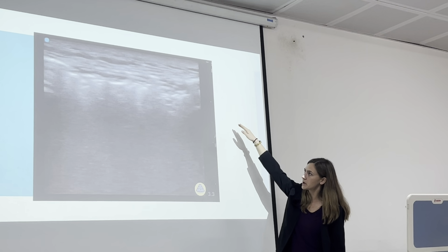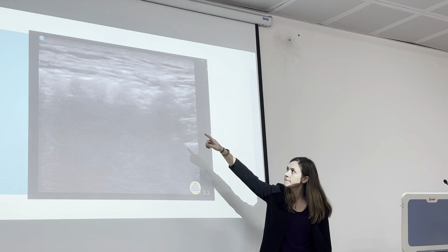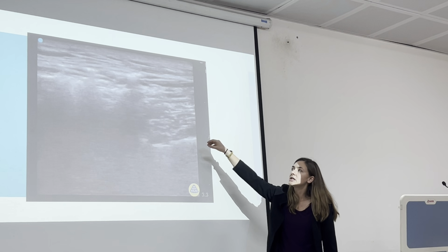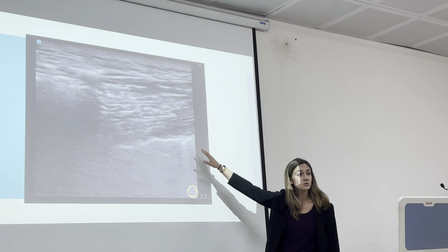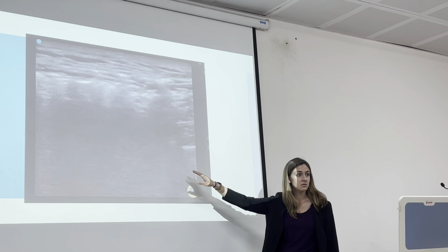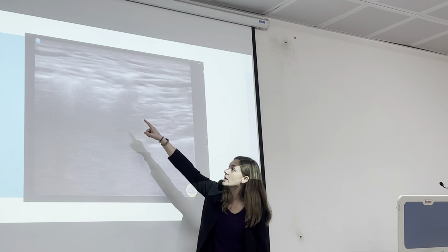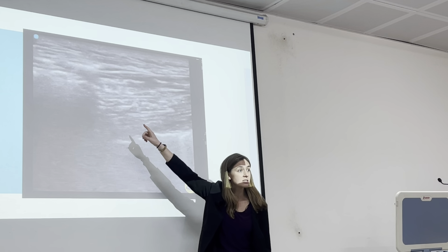And then next, we look to see how your fascial plane is doing. If you think about your ultrasound, and this isn't a lung, but when you look at a lung, what do we look at to see when the lung is sliding? We look at the ants on the log, the bright white twinkling lights that help us show that air is getting there.